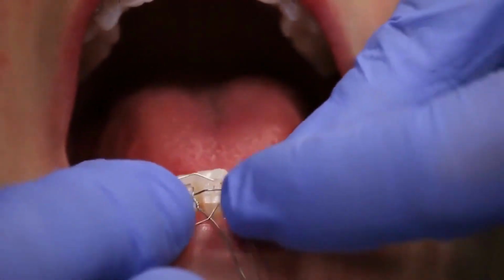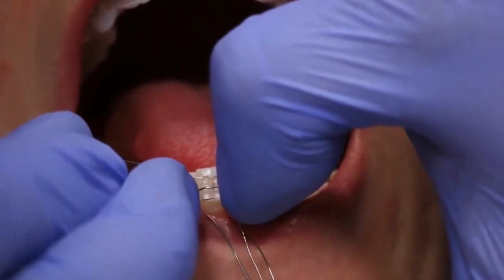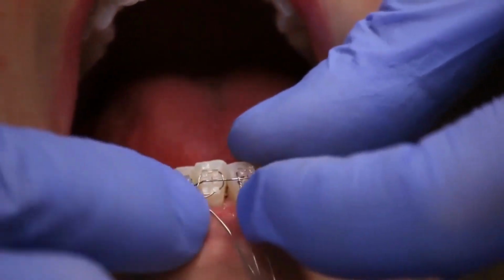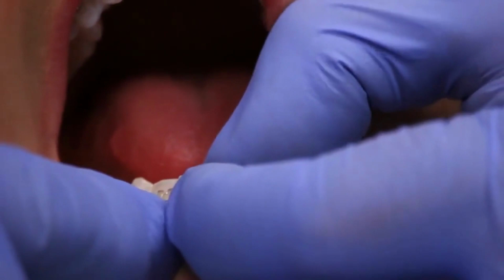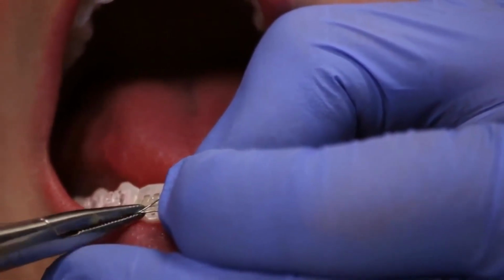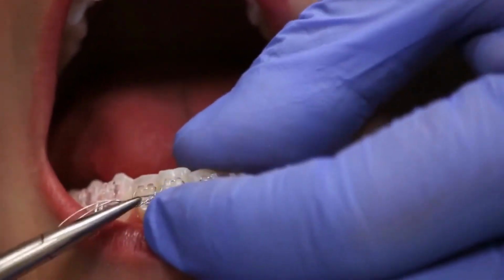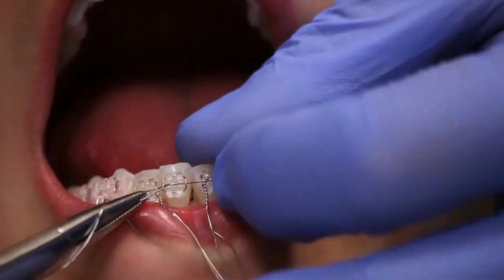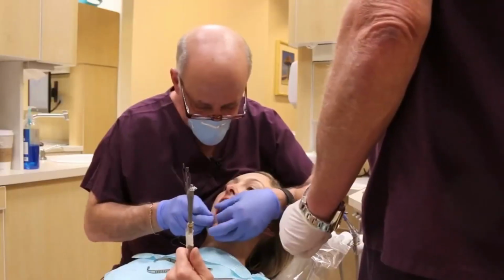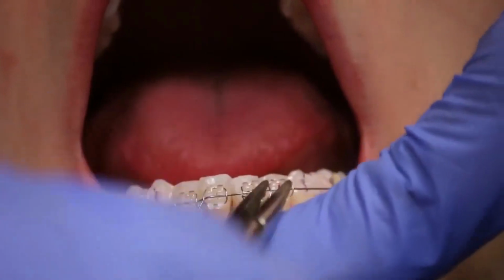So secure the wire and then go and tie the most difficult teeth. You can push with your nail like I'm doing in here to bring the tie close to the bracket. You don't want the distal aspect or the loop aspect of the tie to be too far away from the tooth. And now we just proceed to tie. This lateral also has a small mesial rotation, so the tie also goes towards the mesial.